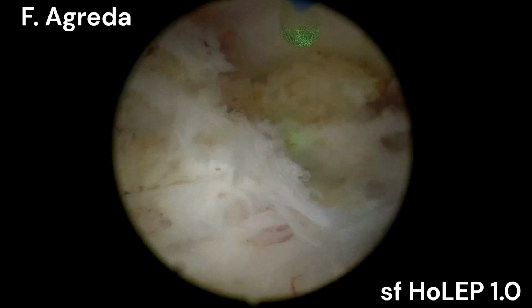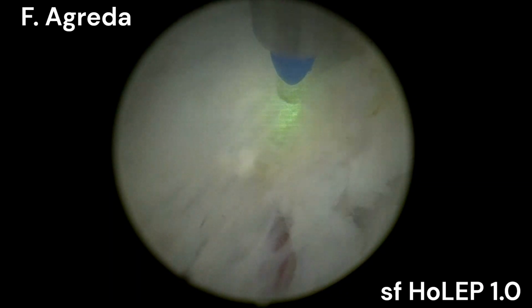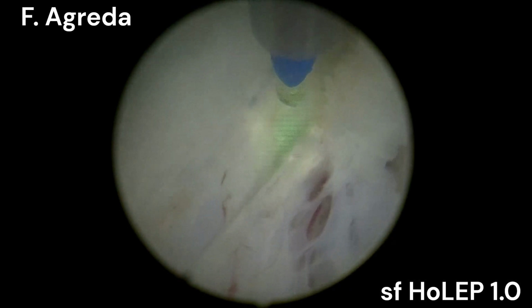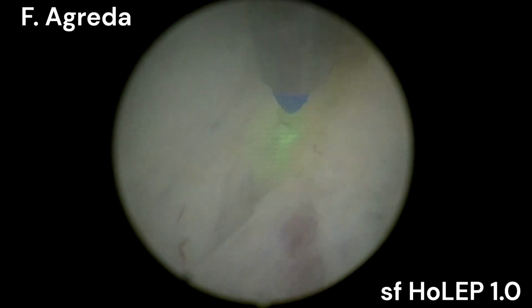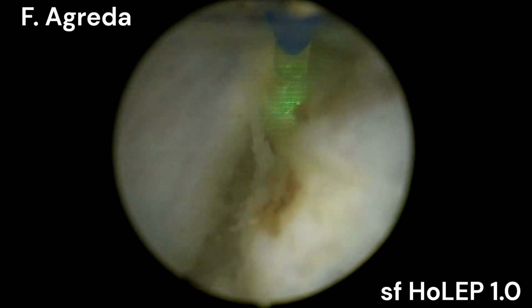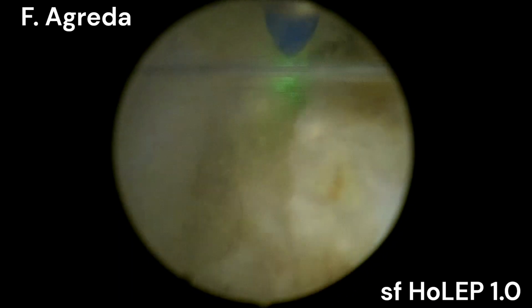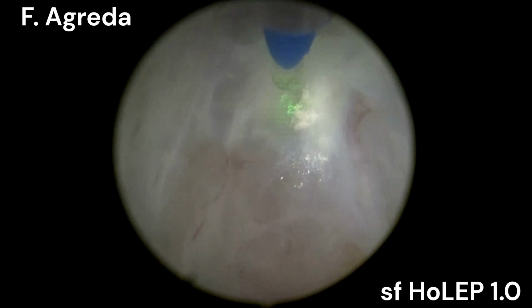It's kind of a block enucleation with a different progress of dissection. So we finally liberate the adenoma to the bladder to do the morcellation. As you can see here, I don't know if you see it, there's some blue spot in the right prostatic capsule that probably is some embolization material. Some blue material used for the embolization.